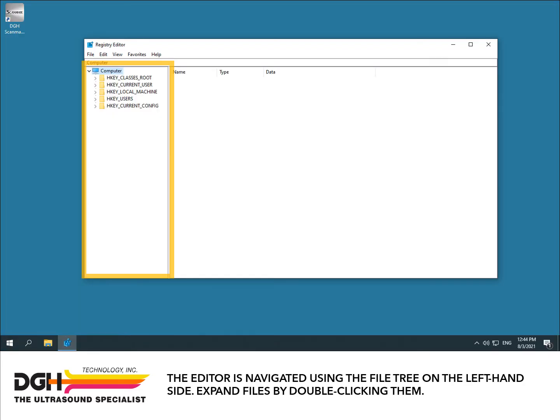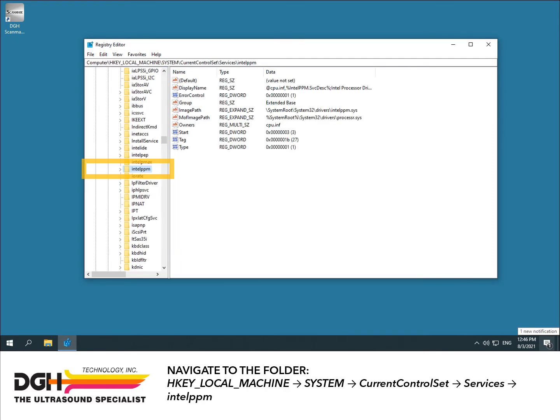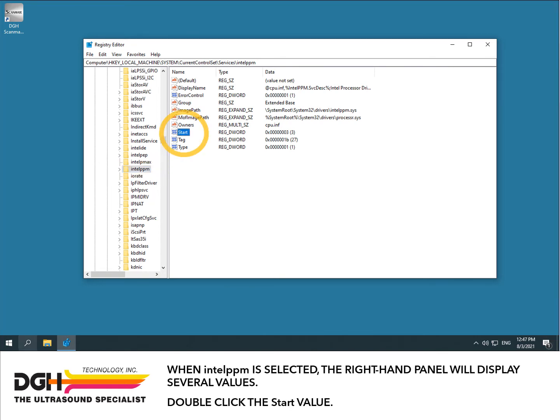The editor is navigated using the file tree on the left-hand side. Expand files by double-clicking them. Navigate to the folder HKey Local Machine, System, Current Control Set, Services, Intel PPM. When Intel PPM is selected, the right-hand panel will display several values.